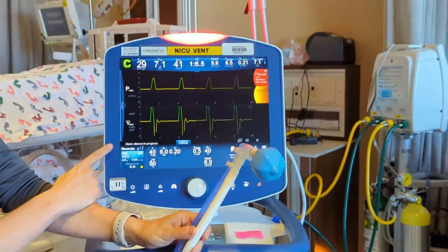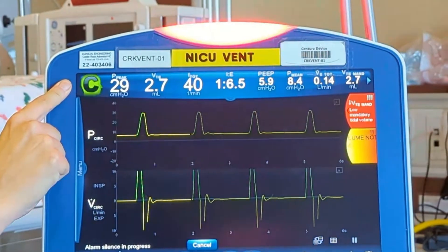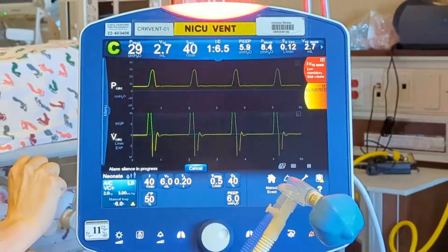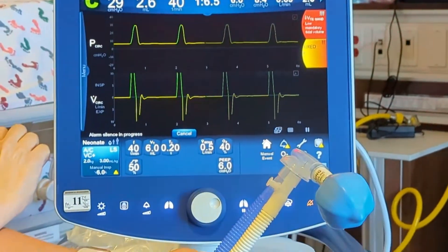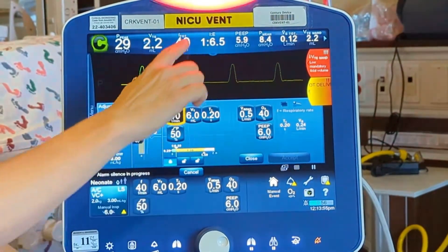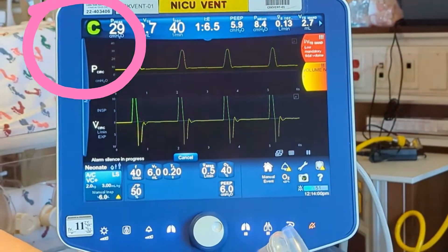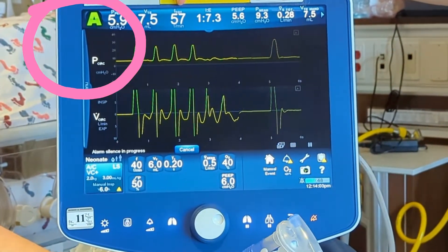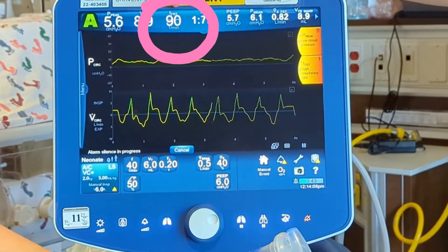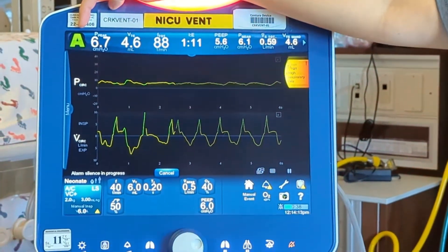We know this baby is on full support because we can see it's on ACVC, and up here it says C — meaning a controlled mode. Right now with rate set at 40, the baby is breathing 40. But if we decrease sedation and the baby starts breathing on their own, you can see their respiratory rate increases, and over here this changes from a C to an A — meaning it's an assisted breath.